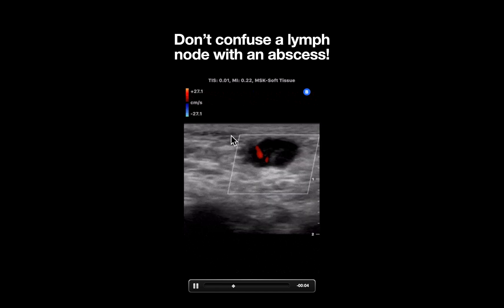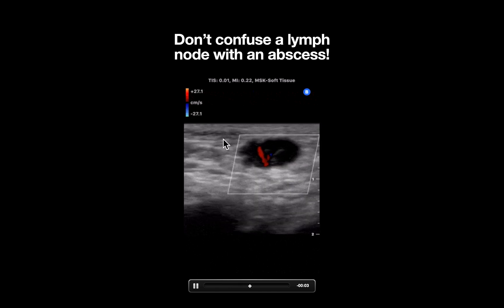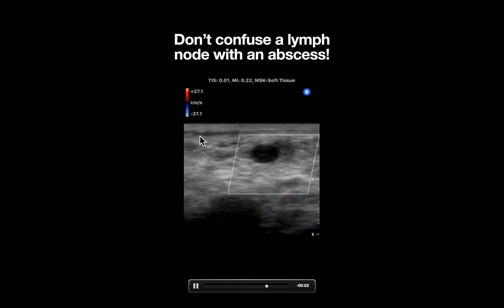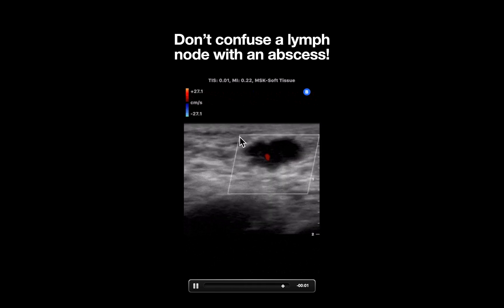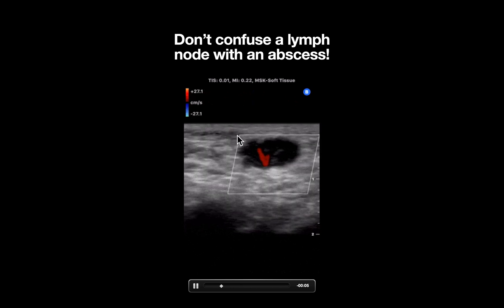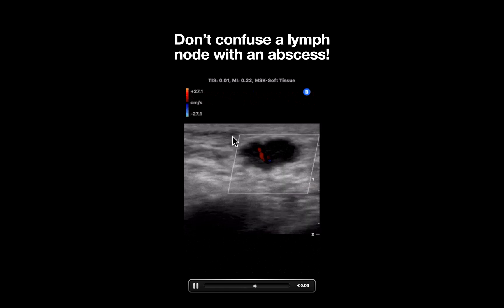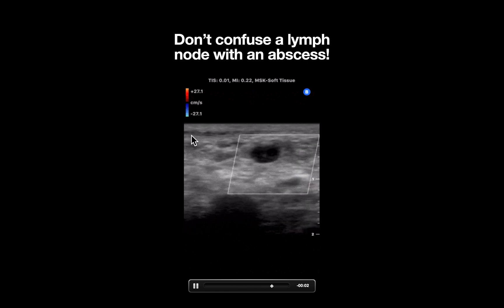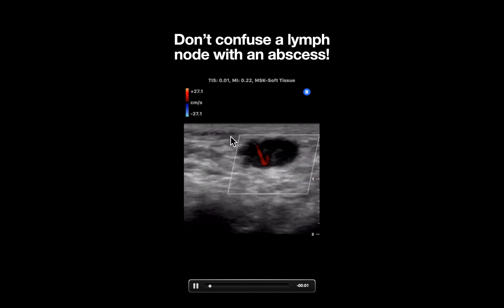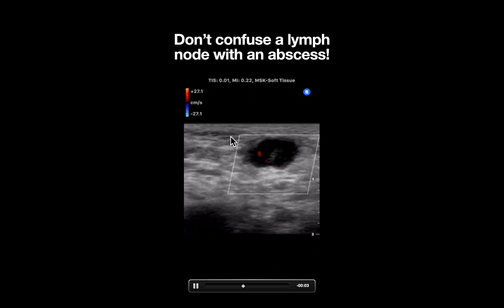Notice at the top of this screen we can appreciate a thin anechoic fluid within this subcutaneous tissue layer, which is likely some edema from local infection or inflammation.